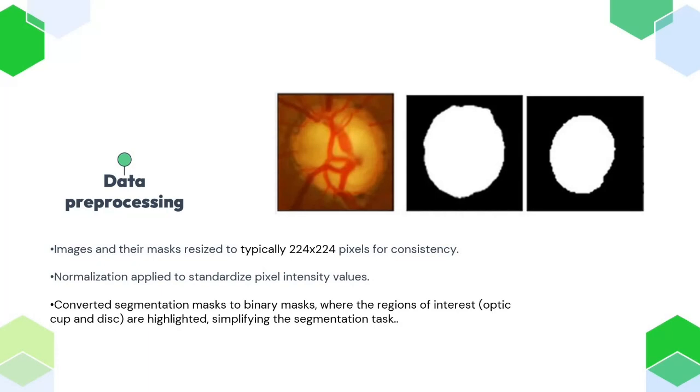Also, we would like to highlight that it's important to note that the original paper does not provide specific details on the pre-processing steps that were used.